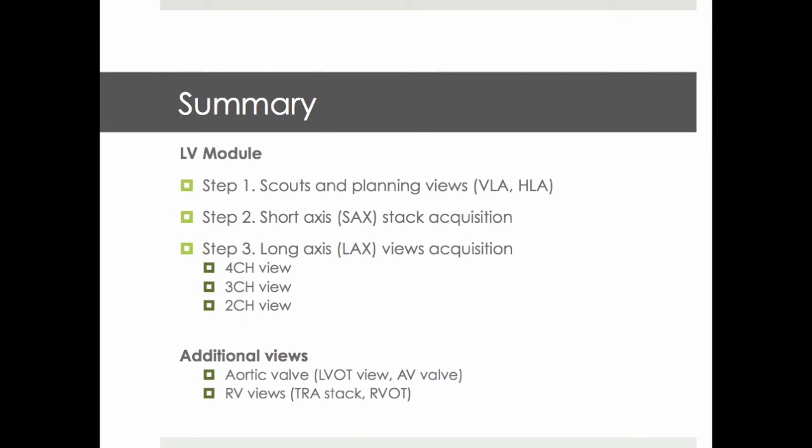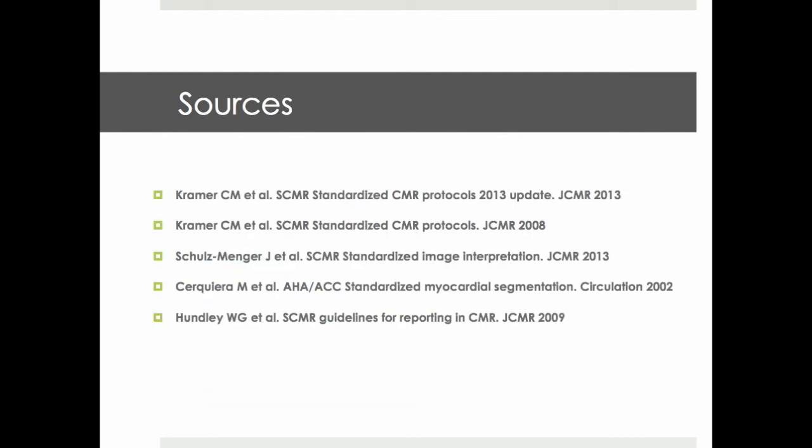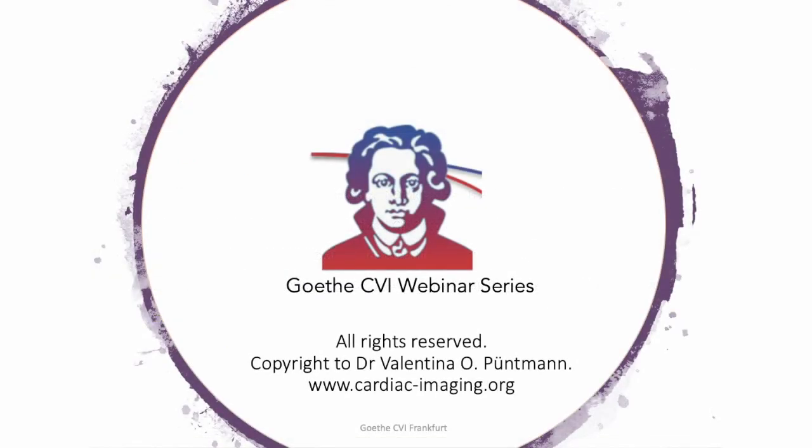Congratulations, you've made it right through the end. In summary, we've looked at the principles of scanning and planning of left ventricular module, as well as a few important additional views. Here comes a list of sources I've used in this presentation for your information.